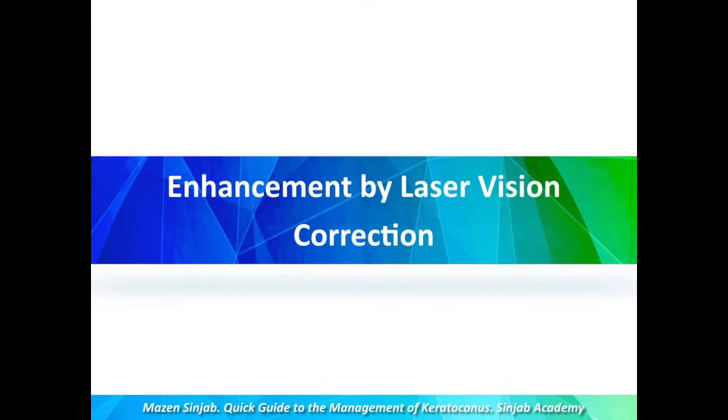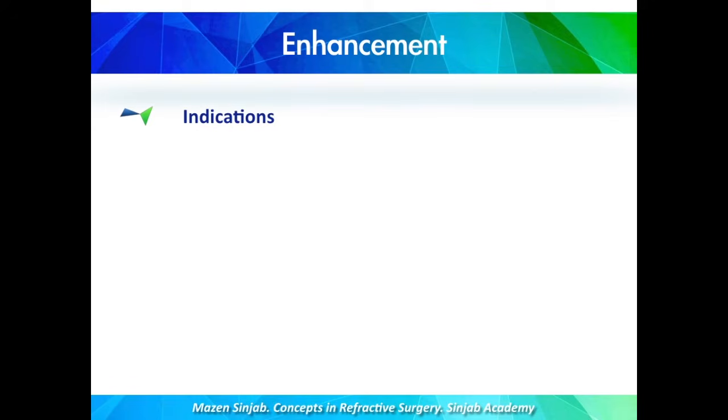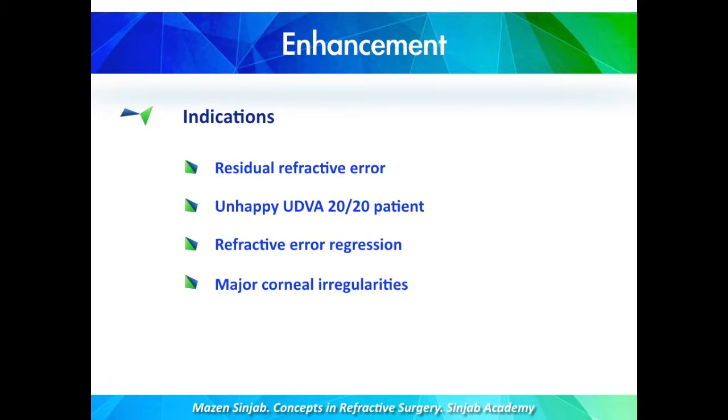Refractive surgery. Part 8. Enhancement by laser vision correction. We will go through indications, workup, management, and types, starting with the indications. Residual refractive error, unhappy 20/20 patient, refractive error regression, major corneal irregularities, and reduced vision due to other pathologies.